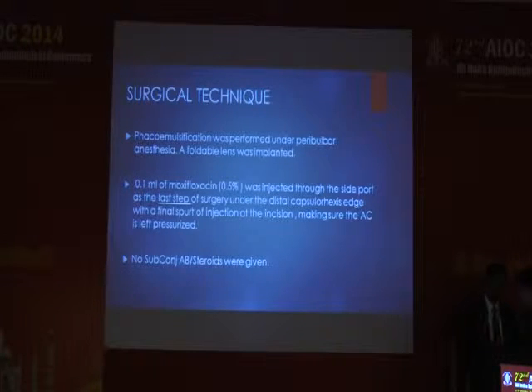Phacoemulsification was performed under peribulbar anesthesia and a foldable IOL was implanted, and 0.1 ml of moxifloxacin was injected through the side port as a last step of surgery under the distal capsular edge with a final spurt of injection at the incision site, making sure the AC was left pressurized and no subconjunctival steroids or antibiotics were injected.